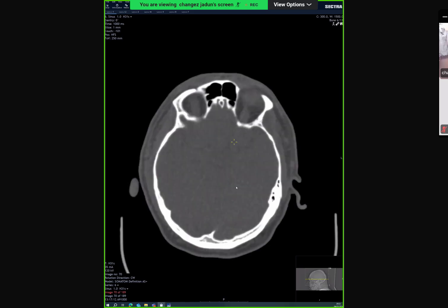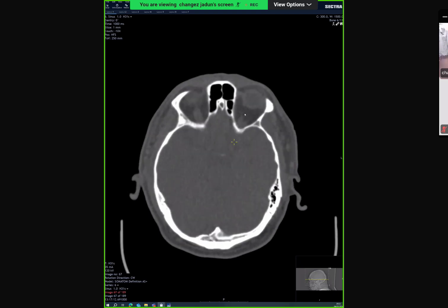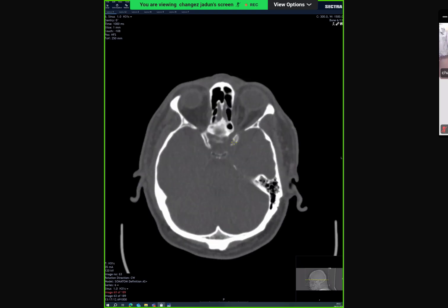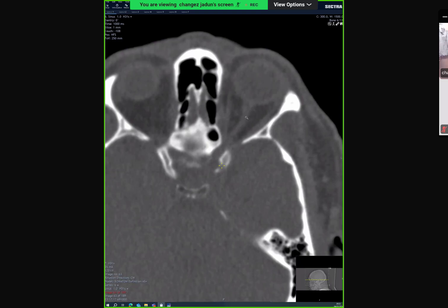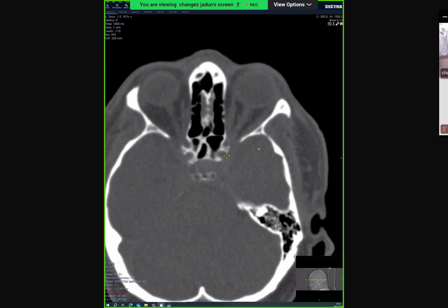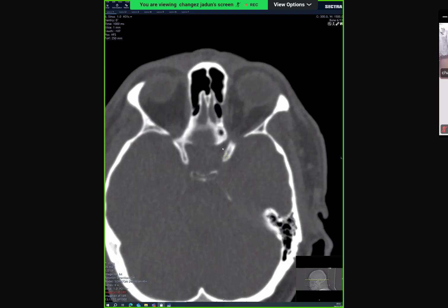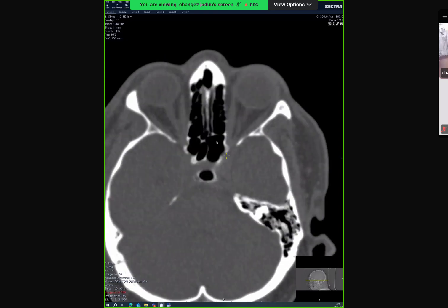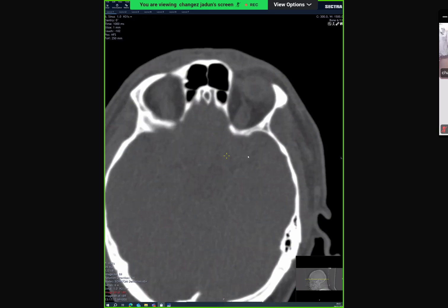You would change the window to look at the bones. You can see the orbits here — you want to see the orbits. You look at the optic canals and the clinoid process. And you want to see there is nothing in the sinuses. All those things you want to see while the CT is there.